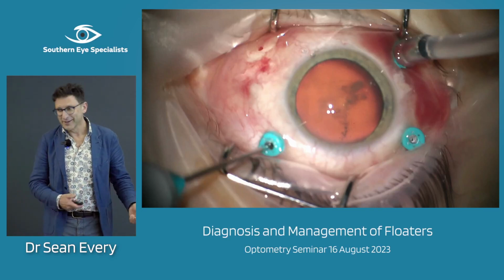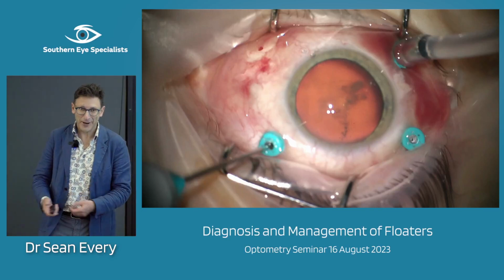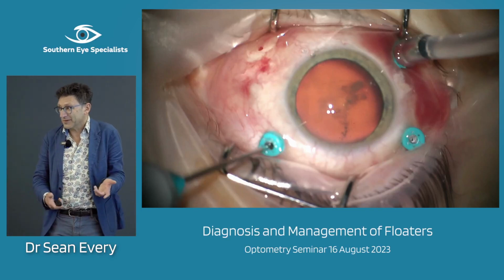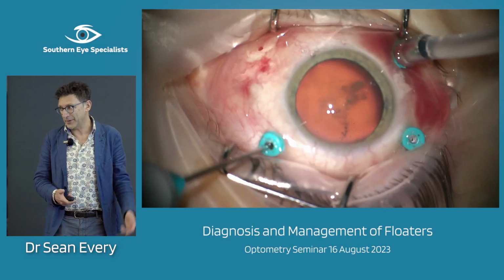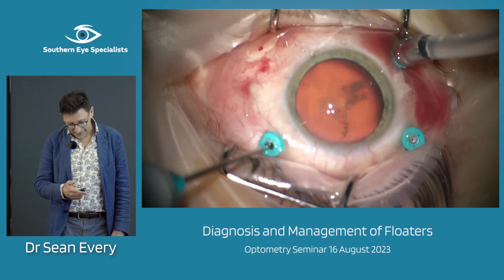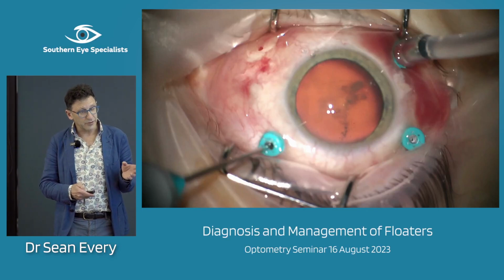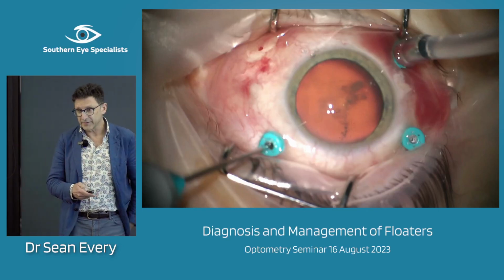I don't usually start my operations by wiggling the eye around, but sometimes I do actually, because it's nice to show the team around you. Well, look at this. How annoying would that be? And everyone nods their head and goes, yes, that would be annoying. But just realize, it's a dynamic space, the vitreous cavity.